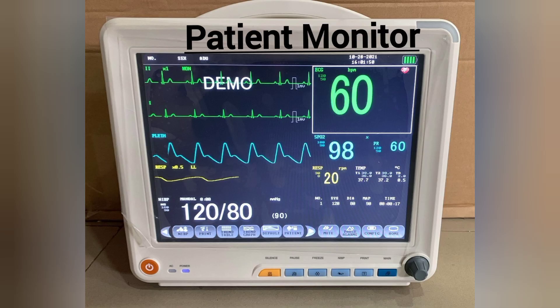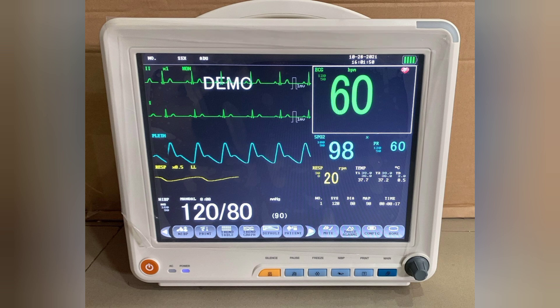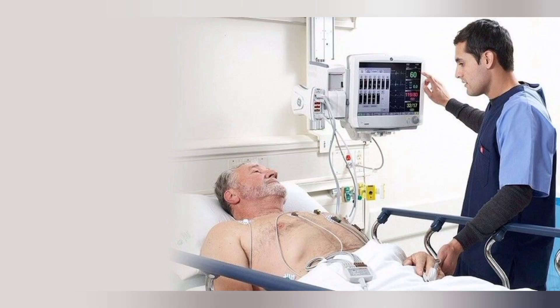First is patient monitor. Patient monitor shows vital parameters of the patient on screen continuously. Parameters include SpO2, NIBP, ECG, pulse rate, respiratory rate, temperature, and ETCO2. Any significant changes in parameters make the monitor alarm to get attention of clinical staff.